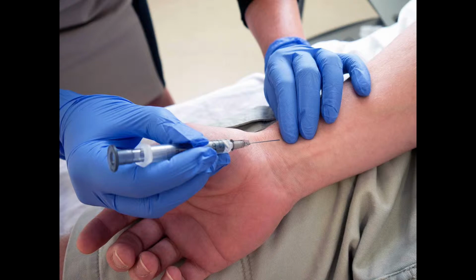Now, whilst there are no actual contraindications for the procedure of performing an ABG, it must be remembered that this procedure is invasive, and so judgment must be used as to the appropriateness of performing the procedure in the pre-hospital setting.